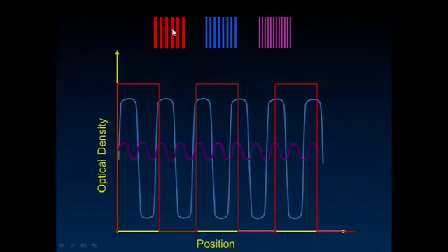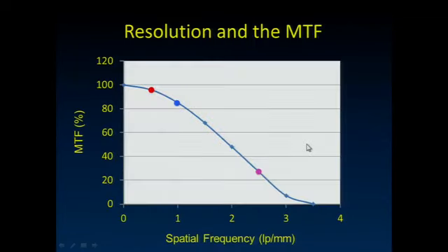It turns out that most systems, as you try to drive to higher and higher resolution, in other words, if you look at more line pairs per millimeter, go from very good fidelity resolution properties to much poorer properties. And every system has some limiting resolution where basically this looks like a flat line. When you take an image of that phantom with a very high number of line pairs per millimeter, it just looks like it's uniformly gray, if you will.